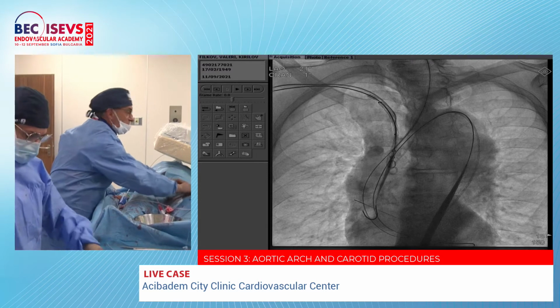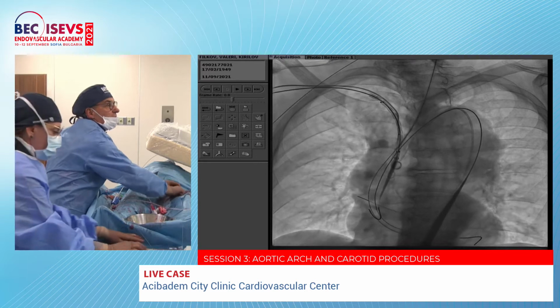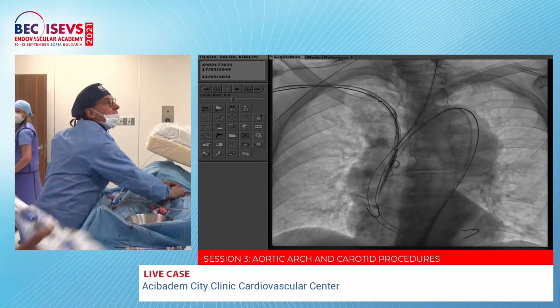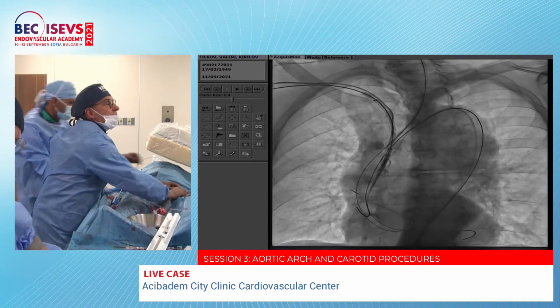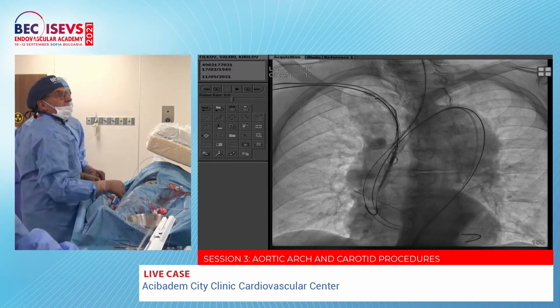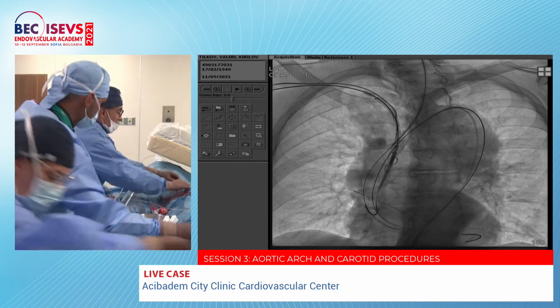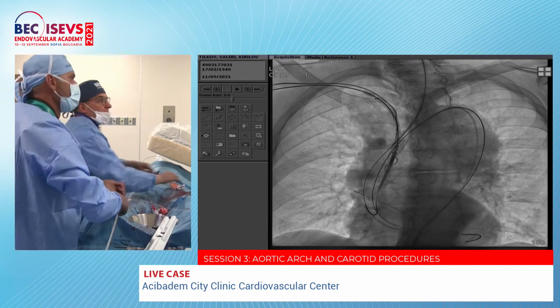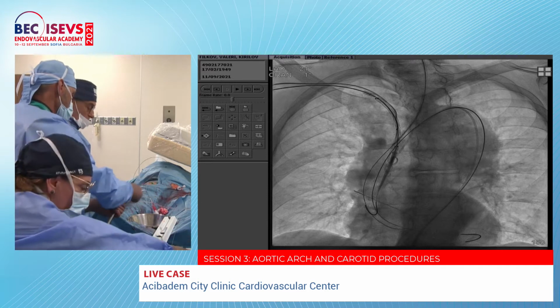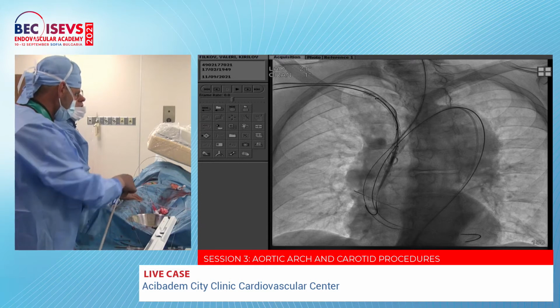Okay, you see the patient is under conscious sedation. Yeah, we're a little bit impressed by having a patient not under general anesthesia. I never did that, only with local, I must say. Yeah, abundant local plus conscious sedation. And he's behaving very well, absolutely fantastic.